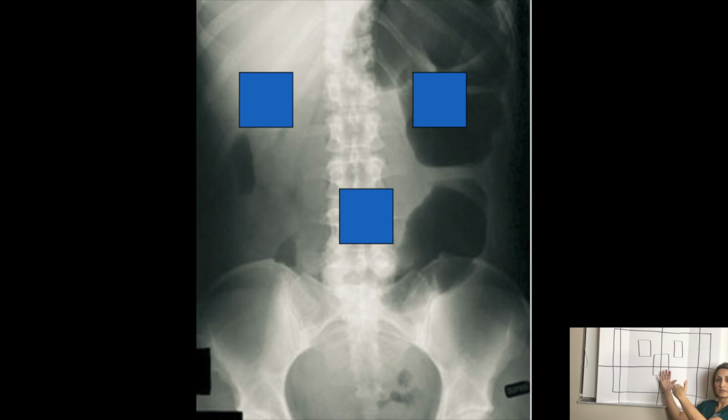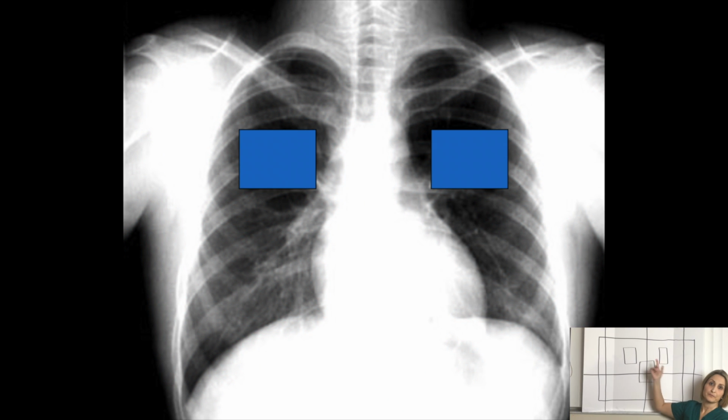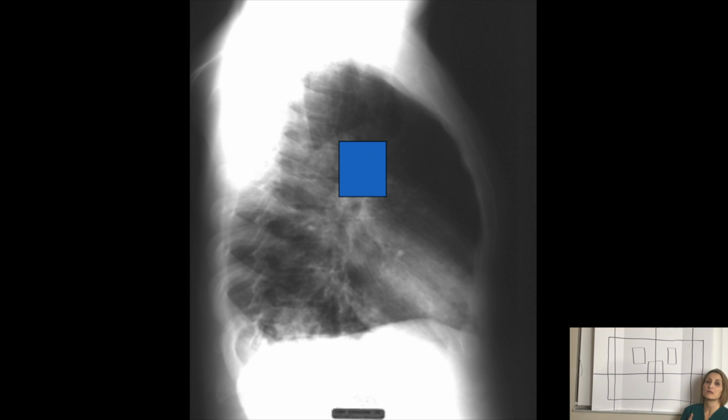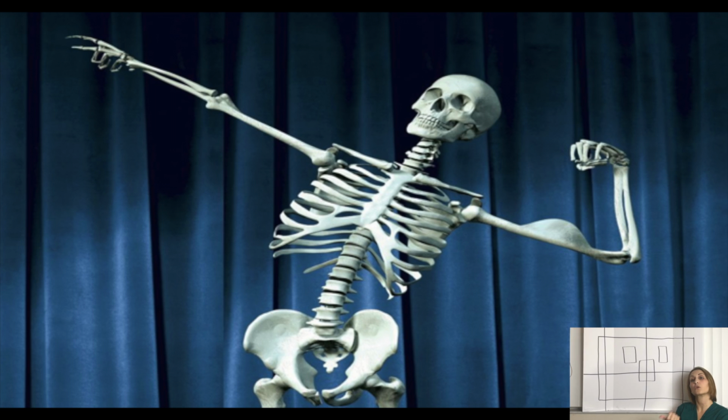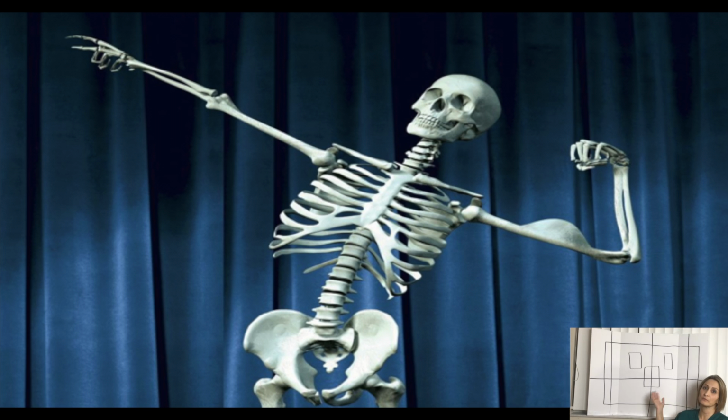The density control should not be used to compensate for patient part thickness or penetration changes. The AEC device is designed to figure out this compensation automatically. The AEC will produce a diagnostic exposure for any tissue that is positioned correctly by the radiographer.